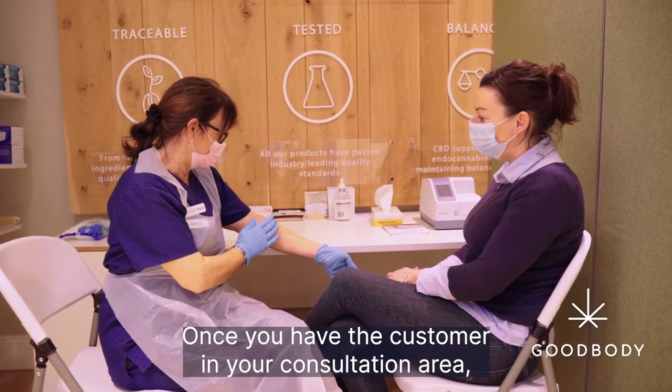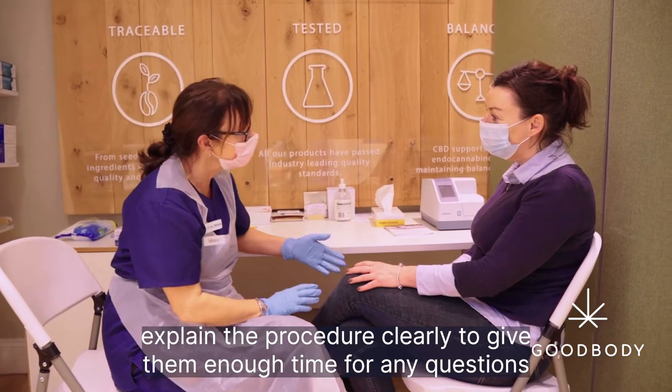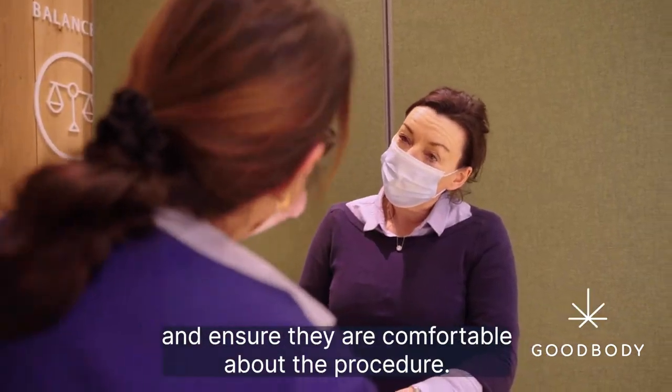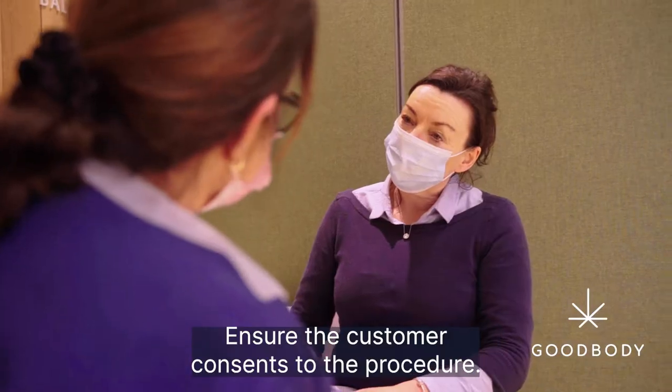Once you have the customer in your consultation area, explain the procedure clearly to give them enough time for any questions and ensure they are comfortable about the procedure. Ensure the customer consents to the procedure.